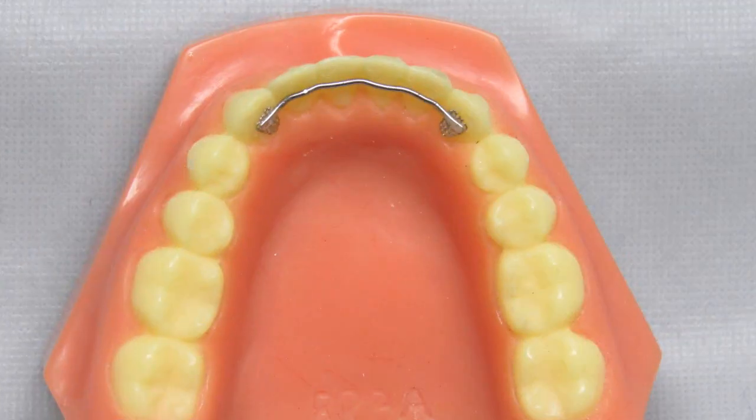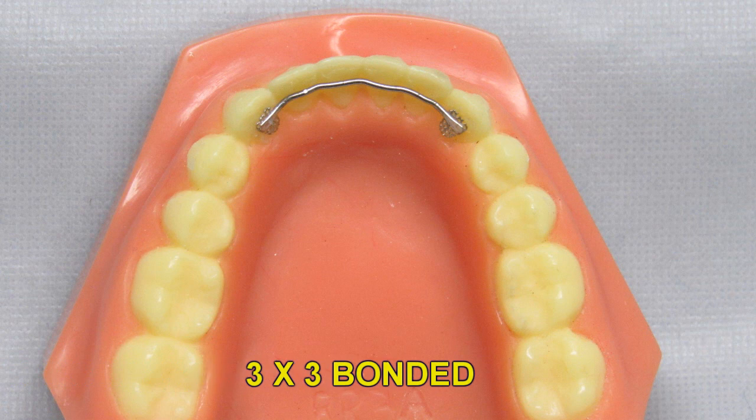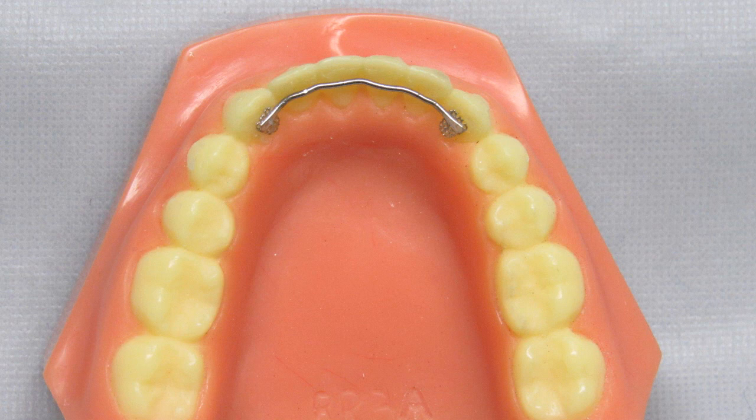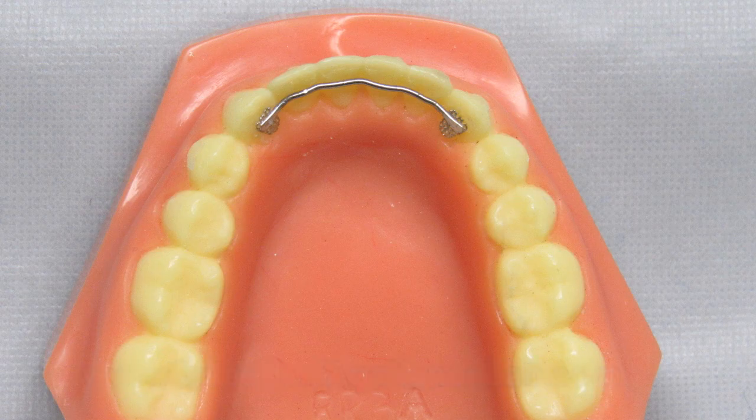The traditional lingual bonded retainer is the 3x3 bonded retainer with bonding pads on the cuspids. The retainer consists of pads on the cuspids similar to the pads on a bracket, and a wire closely adapted to contact each individual tooth. The lingual surface of the cuspids are prepped the same way you would the facial surface if you are going to bond a bracket. It is recommended to use a glass ionomer cement or composite to bond the retainer in place. This is normally worn on the lower arch, but it can be made on the upper arch — be sure to send a lower model if you would like one made for the upper arch so we can check for interferences with the lower anteriors.